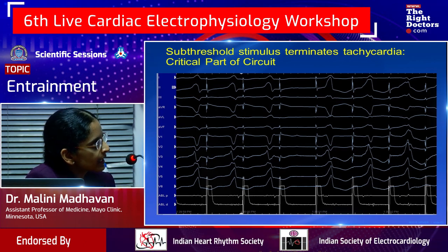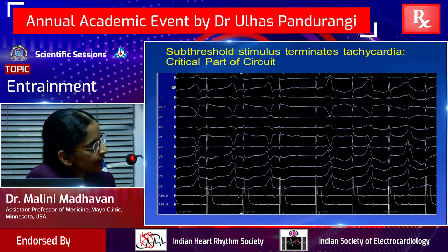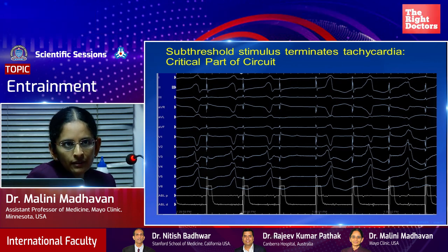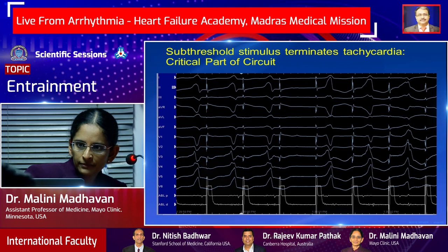So same patient, again pacing, you have subthreshold stimulation, termination of tachycardia, and then the beat after that captures with a different morphology. So that's actually the paced morphology, okay? So that's subthreshold stimulation with termination of tachycardia.